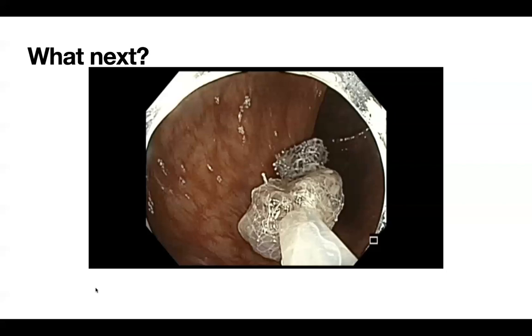For some of these SSAs, they're usually pretty soft lesions generally, and they can be suctioned into the scope. Of course, it could get fragmented, and so that's always a possibility. But again, we know that it's an SSA. In the context of this case, this patient had a very difficult left colon to navigate through. So I'm wondering if you tried to just suction the polyp, or you always wanted to do the snare for complete removal and then you would go back in again.